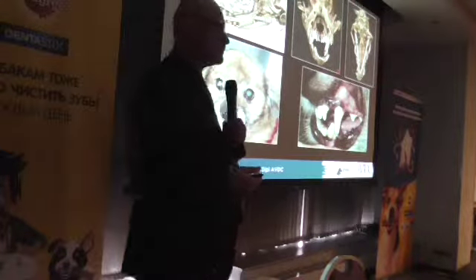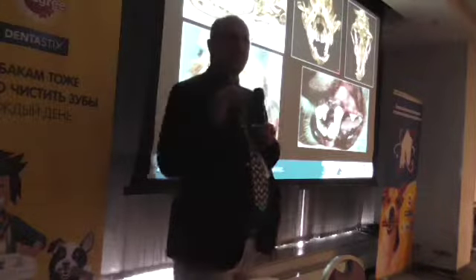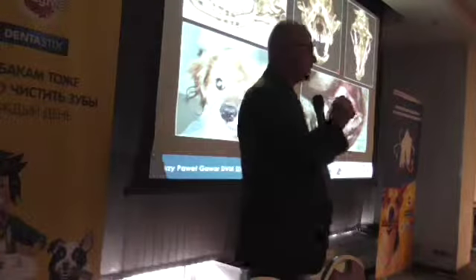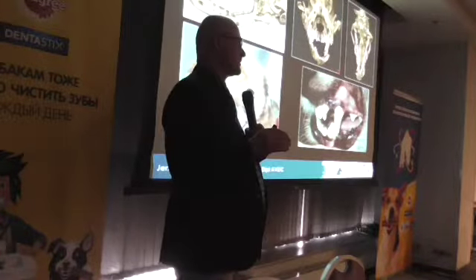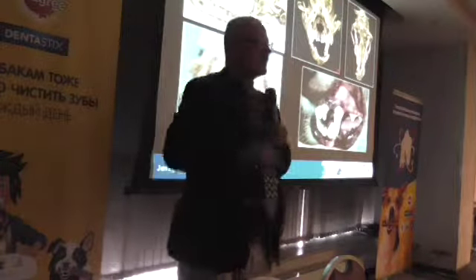However, it will never replace a real bone. It is only a prosthetic solution, so it is temporary. We didn't do the bone regeneration case because that was too complex, and we only wanted to implement the missing part of a mandible.